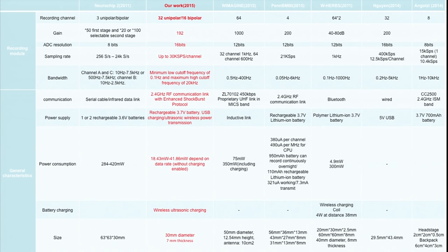And according to our partners who work on primates, we have a lot more space to grow. It looks like there is a lot more space in the skull where we can grow our circuit. We don't need to grow. And we have well-integrated peripheral sensors for measuring EMG and other external signals. They are all connected around the same wireless architecture to enable researchers to do creative thinking.